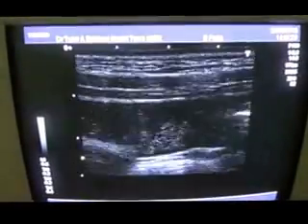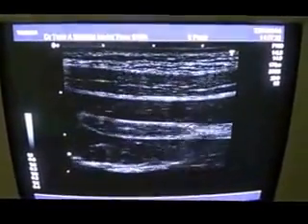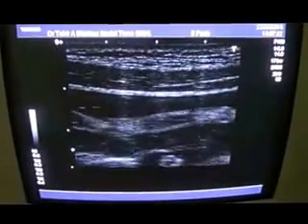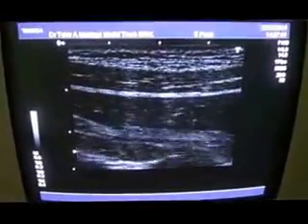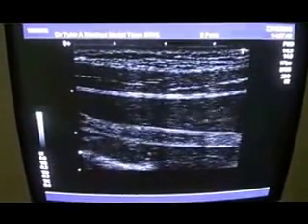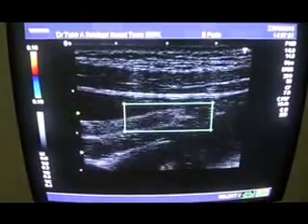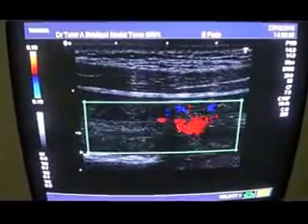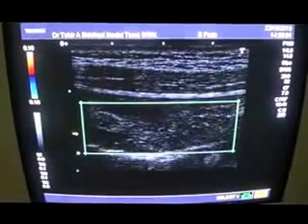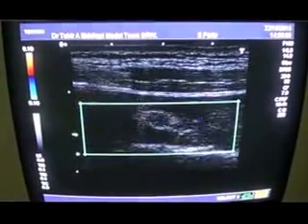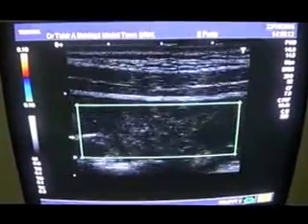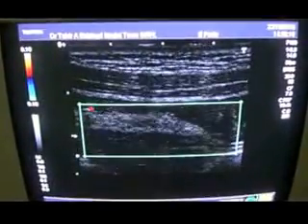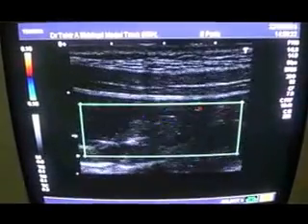This is a worm within the bowel of a child with a history of abdominal distension and constant pain. You do not see any evidence of blood flow within this structure. This structure can be nothing but a worm within the lumen of the bowel.